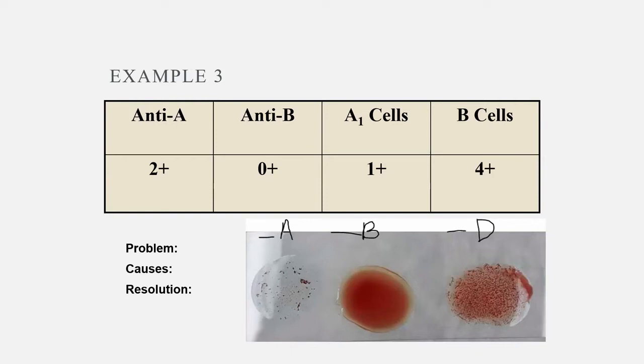Did they just test a bunch of seeds, milk, water with a bunch of cells and see what happened? We know about a lot of different lectins. It's kind of cool. But anyway, A1 lectin will react with A1 phenotypes, but it will not react with A2 phenotypes.